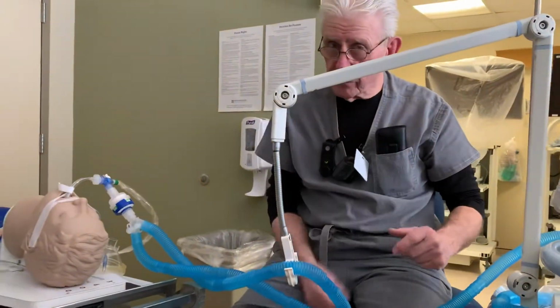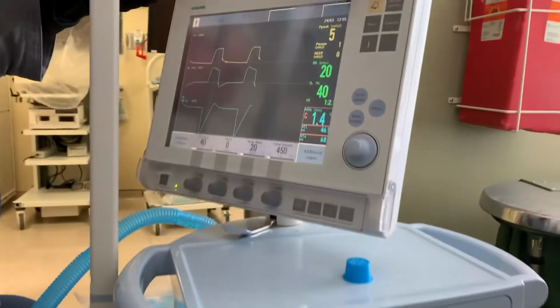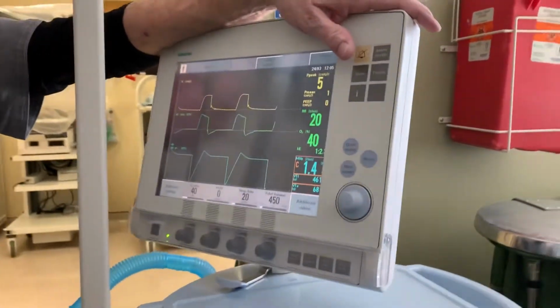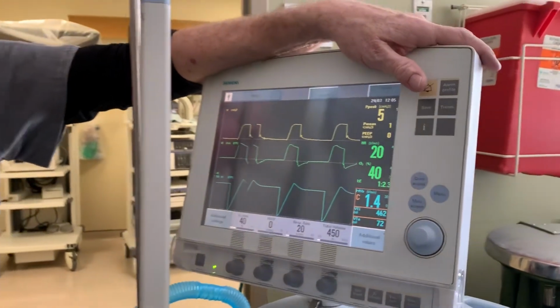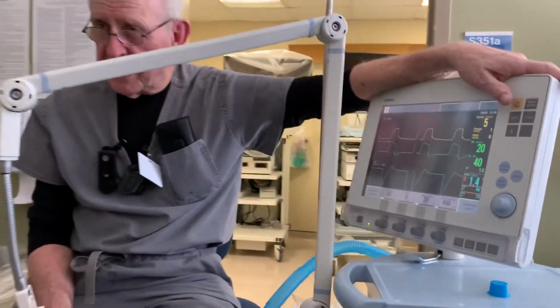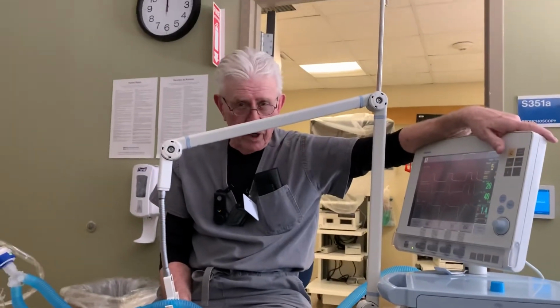Another question? Yes, when you press that 100% suction, aren't all your alarms silenced for 2 minutes? So you should make sure you stay attentive to the patient. But usually you've taken care of that, yes. Probably during that period of time you wouldn't have to worry about alarms.